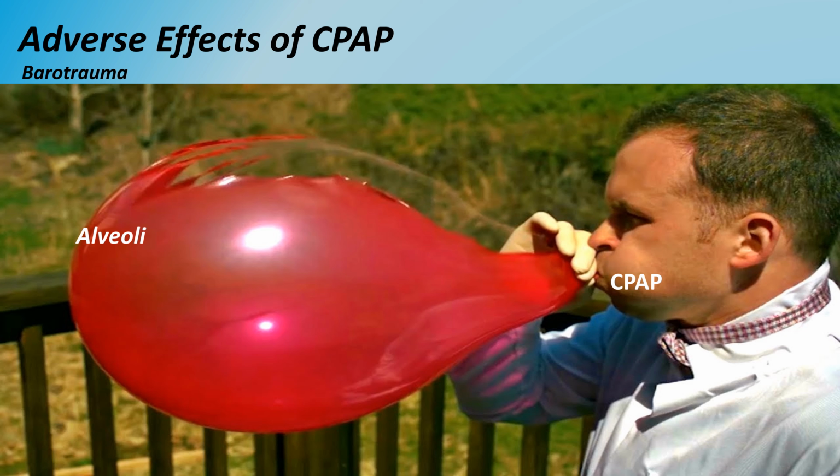Speaking of titrating up with our CPAP, once we get the CPAP on the patient's face at our low pressure, we want to keep our increases in titration at least 5 minutes apart. If you have good compliance from both the patient and their lungs, and there's an improvement in patient condition, there's no need to push your luck and just keep increasing pressure for no reason. Once you have found that improvement sweet spot for your patient, we're just going to leave it right where it is.